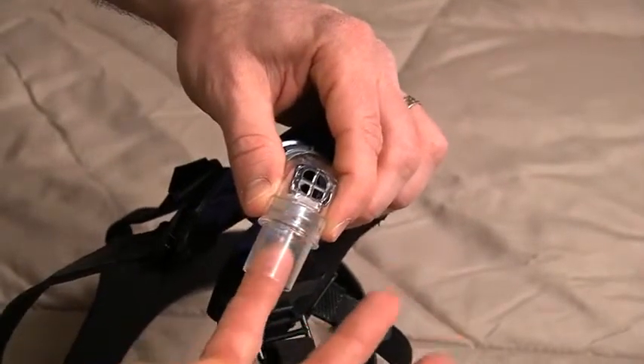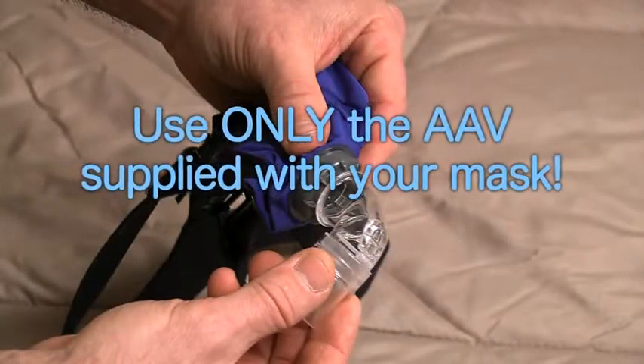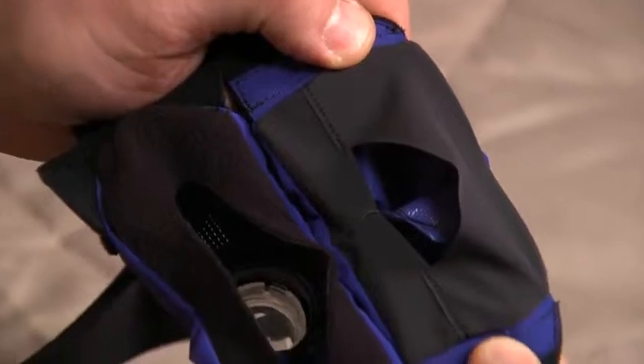The 90-degree elbow with AAV is a safety feature of the SleepWeaver Anew. Only use the AAV supplied with your mask; do not substitute any other elbow or AAV. The nasal interface of the mask covers the nose with soft, comfortable cloth.